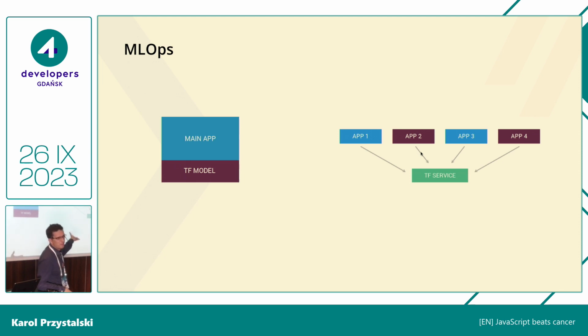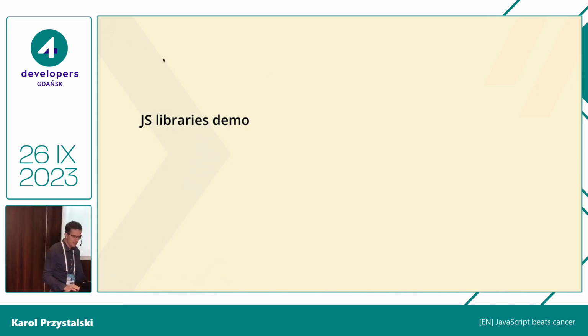Actually, both. On one hand, you need to give the doctors the possibility to work offline. But to be precise and retrain the model, you should actually allow the solution to send this image to the server, to the service, and allow it to retrain. Just to make it more and more precise. Anyway, the models that I have created are better than the dermatologist, so it's good enough, but making it more precise is even better. All right, so let me show you one thing. Click.